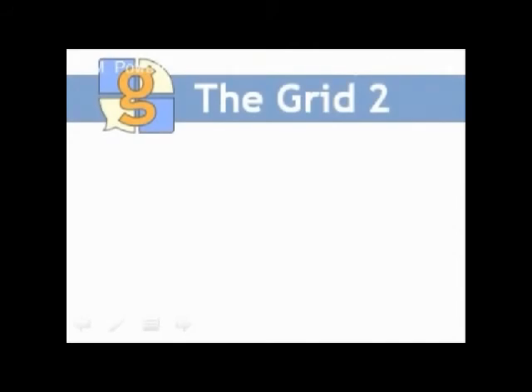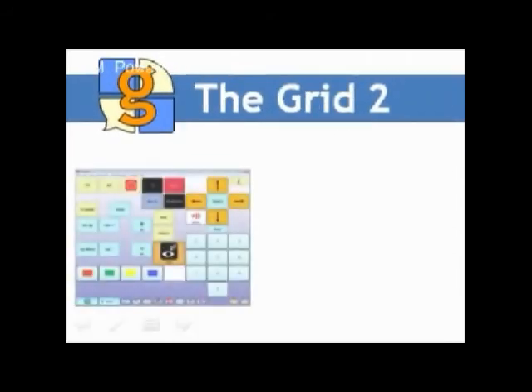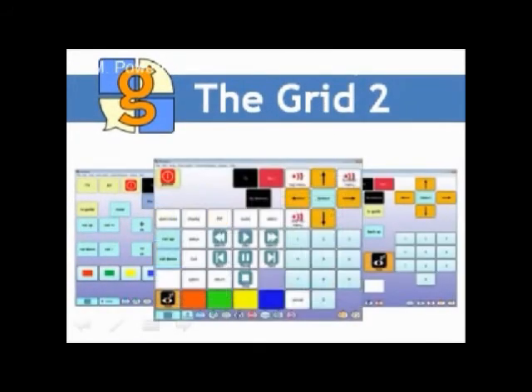The Grid 2 software also provides environmental control. I designed grids based on the remote controls for my TVs, skyboxes and DVD player, programming every cell by capturing the infrared codes from over 150 buttons was very tedious. I deliberately have identical TVs and DVD players throughout the house to minimize this programming, but it is still laborious.